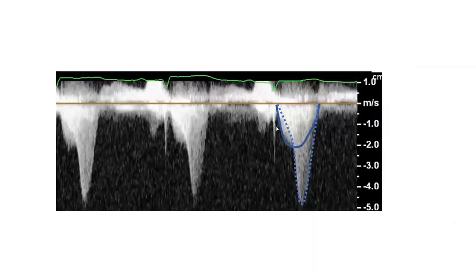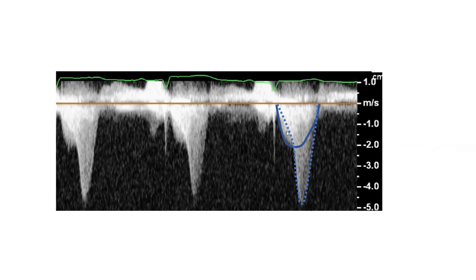Here is an example of the opposite situation — a continuous wave Doppler waveform across the aortic valve showing superimposition of two distinct waveforms: one early rounded waveform corresponding to aortic stenosis, and another much higher late-peaking dagger-shaped waveform corresponding to dynamic LVOT obstruction. Unlike the prior case where aortic velocity and gradient was highest, here the LVOT velocity is highest — and is this patient's primary predominant pathology. He has severe LVOT obstruction with concomitant mild aortic stenosis.